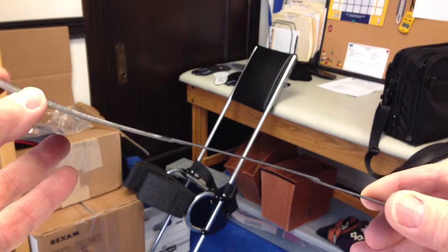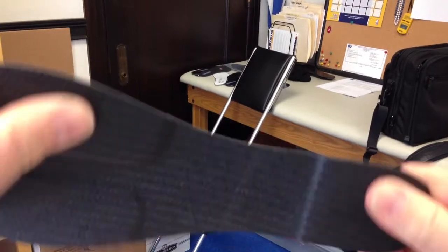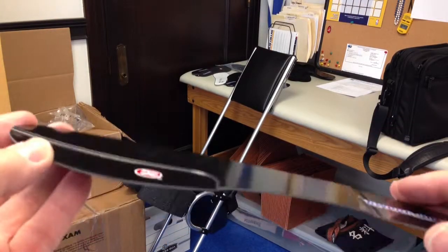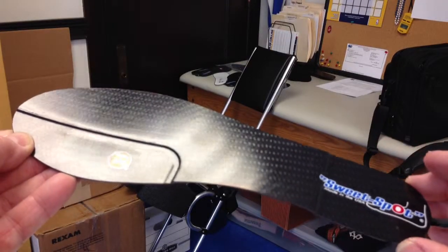The blade, like all our blades, is very thin — four thousandths of an inch thick. They're flexible, except where you need it to be rigid, which would be underneath the fractured sesamoid or the damaged sesamoid. So that's our X1 blade for sesamoiditis.